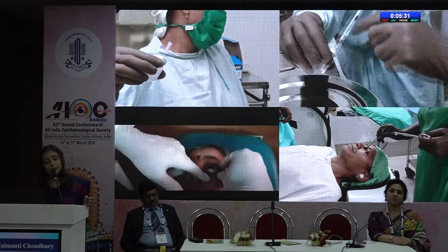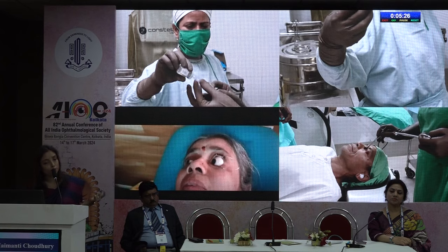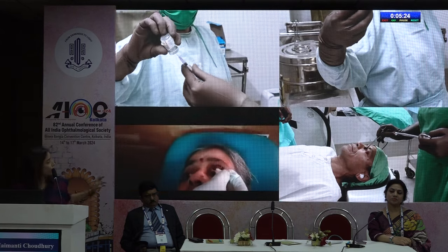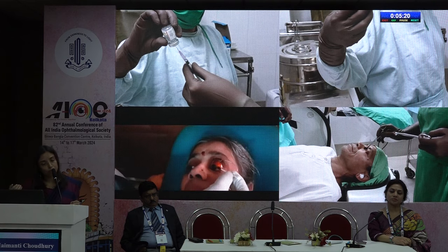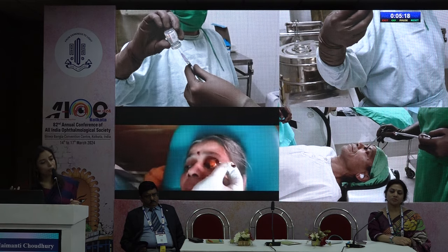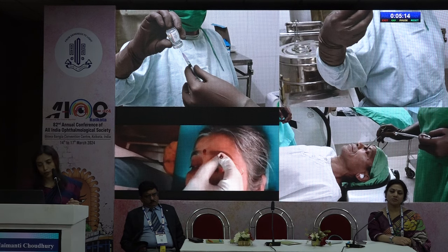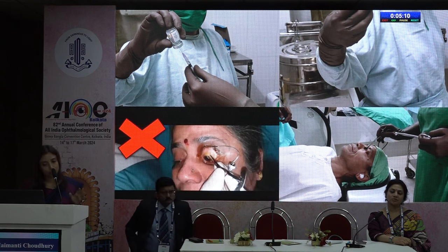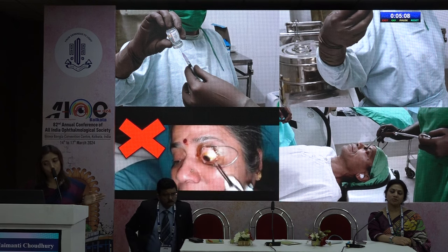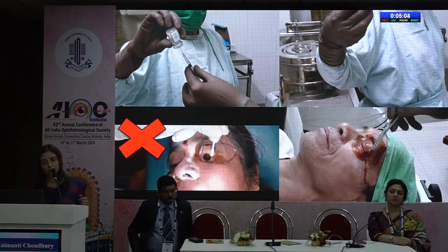Now, since this is a mistake session, let me also show you a mistake video. The bottom video, left side, is a mistake video where you are seeing the patient is sitting in an OPD chair. There is no draping, and the surgeon is going for the injection. In the Indian scenario, this is a mistake. We would definitely not do that because this is not recommended by the VRSI and AIOS guidelines.